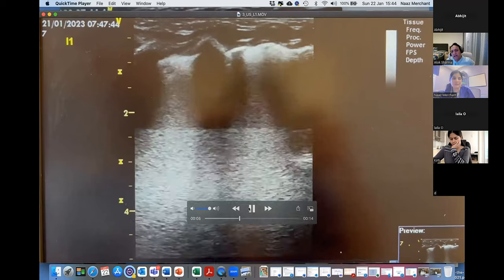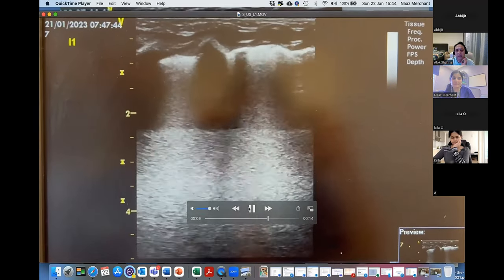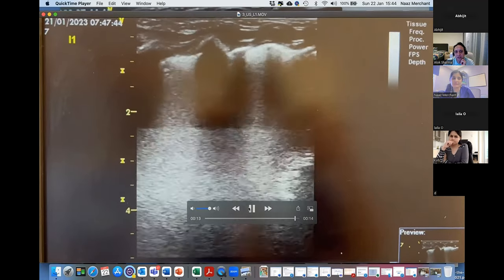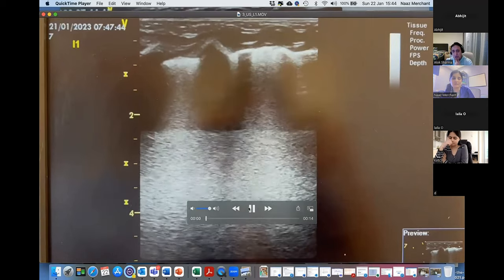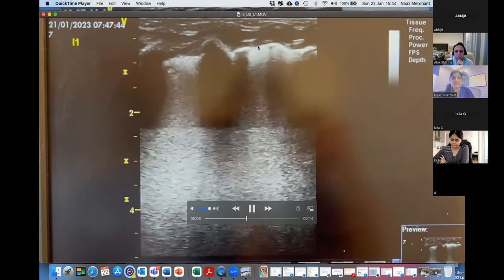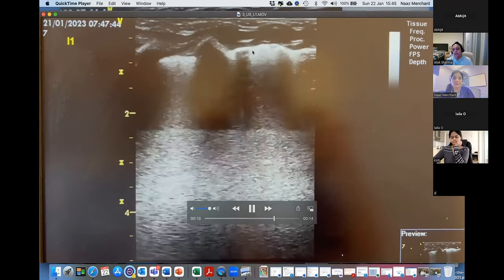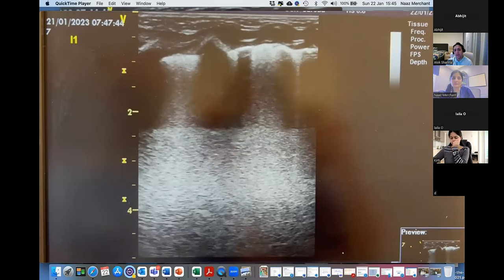Again, a very complete B profile, with a very irregular pleural line at this particular point, which might reflect the fact that you have subpleural consolidations. That would probably be reflective of trapped meconium causing subpleural consolidations, often distally. You can sometimes see deeper consolidation like you saw in the first bit. So is it these ones? Yes, these are subpleural consolidations, and they reflect that you've got meconium in the airways, which is causing the consolidation of that part of the lung.